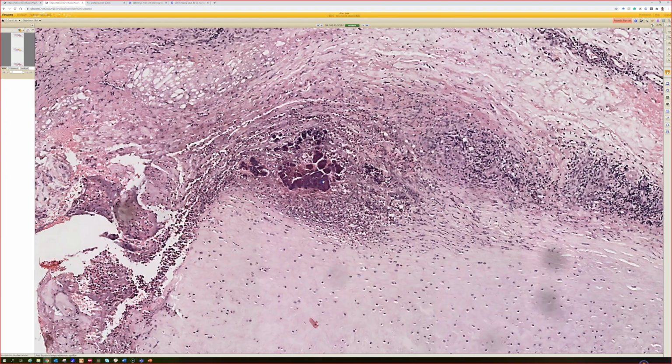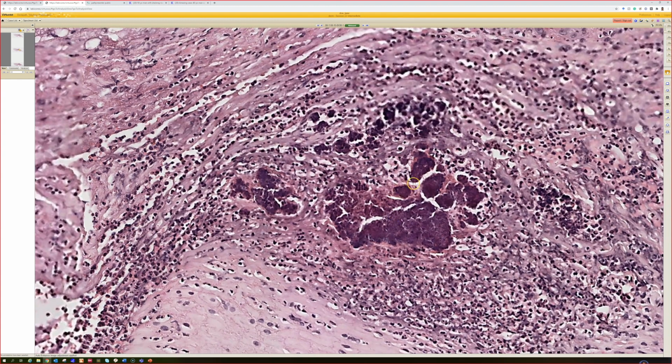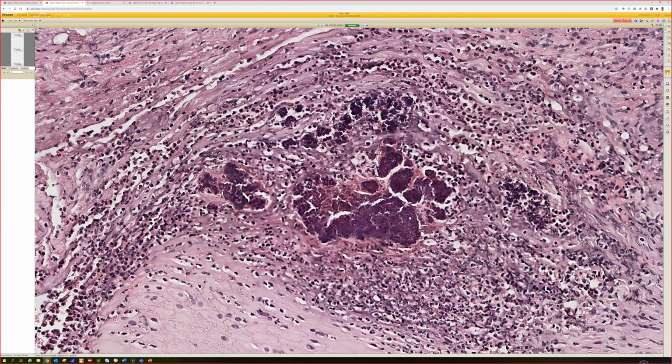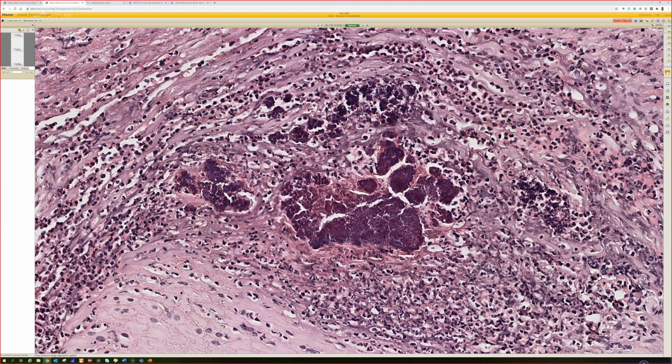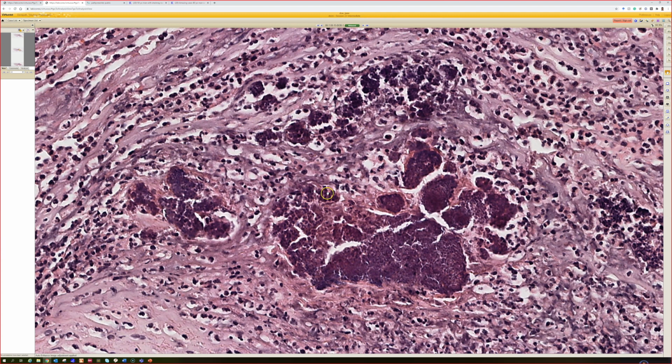All right. And yeah, here we got some neutrophils, and right above the cartilage, a purple blob with a little bit of pink layering around the outside. So what is this? Bacterio... Yeah, botryomycosis. And so what is botryomycosis actually? Do you know? Like a clump of staph. Good. And I wish I could get you to see them better, but that's what you're seeing here.